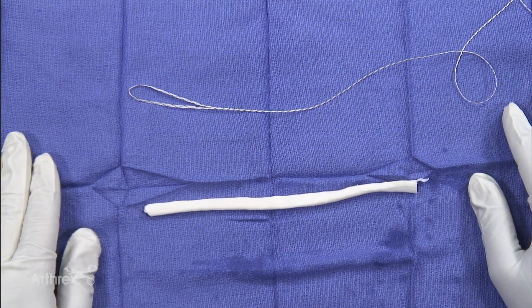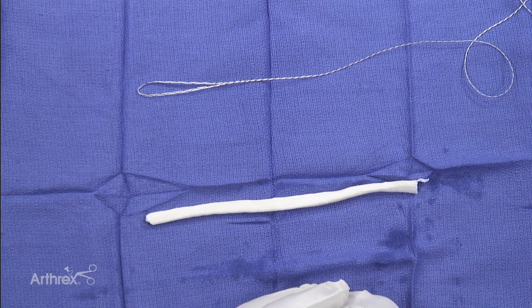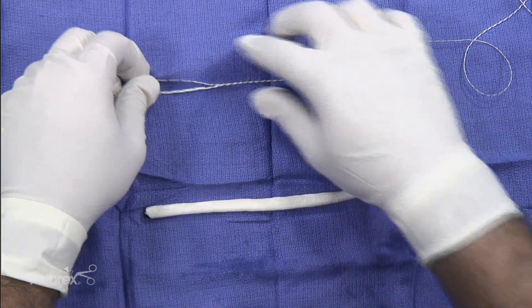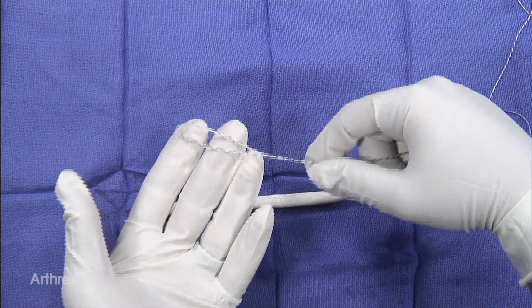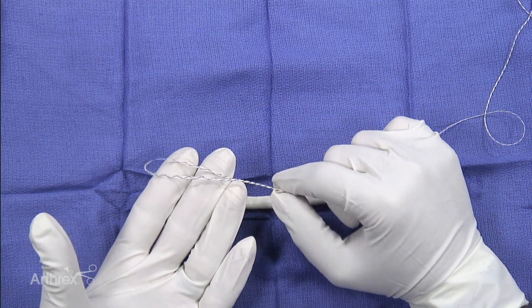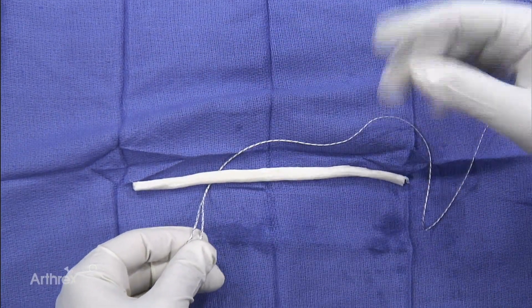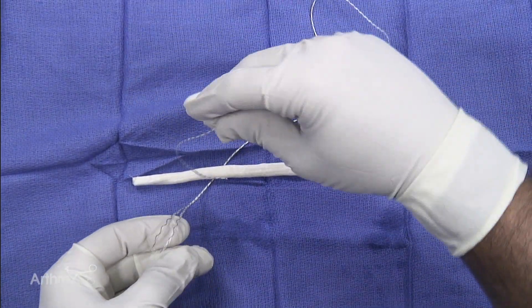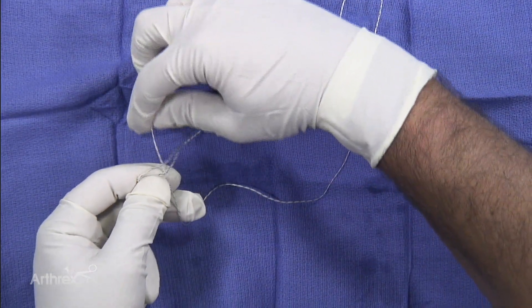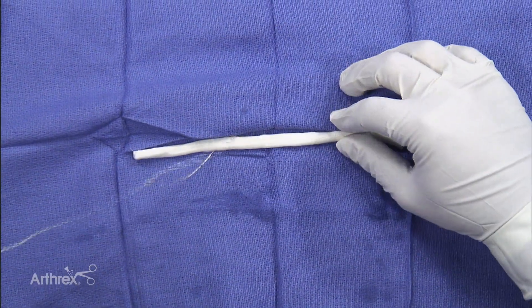We are going to demonstrate the suture tape link suture for use with the LupinTac stitch, using a bovine tendon. Some of the key features of this stitch is that it has a two-and-a-half inch, or about 50 to 60 millimeter loop, that is ideal for going around tissues. The key aspect to this stitch is the first part, which is just a standard loop — you essentially, intra-articularly, will pass the suture around the tendon and then pass the suture through its loop.